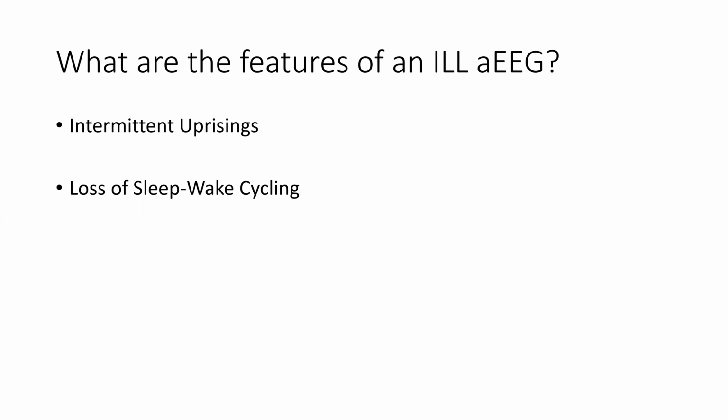So this to me begins to tell me that the brain is not tolerating that level of hypoxia, and that maybe it's time to have a conversation about that. Adding on NIRS can give you some kind of secondary backup for those kids, especially where you can say, I'm seeing this lack of sleep-wake cycling. What's the actual brain saturation? And so although systemic sats may be good, you'll be surprised how low the cerebral sats are. And that can, again, help have a conversation with that.